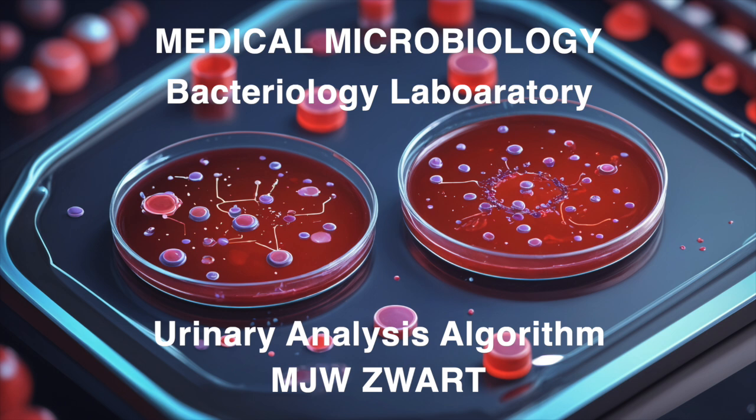I like that. Imagine a scenario where a patient has a recurrent UTI, and the clinician wants to compare the bacteria from the current infection to those from a previous one to see if there have been any changes in resistance patterns. Having access to those archive samples could be incredibly valuable in that situation. It would. It's like having a historical record of the infection. Exactly. And the document provides specific recommendations for how long to store different types of samples. So for routine urine cultures, they suggest storage for 3 days at 4 degrees Celsius.